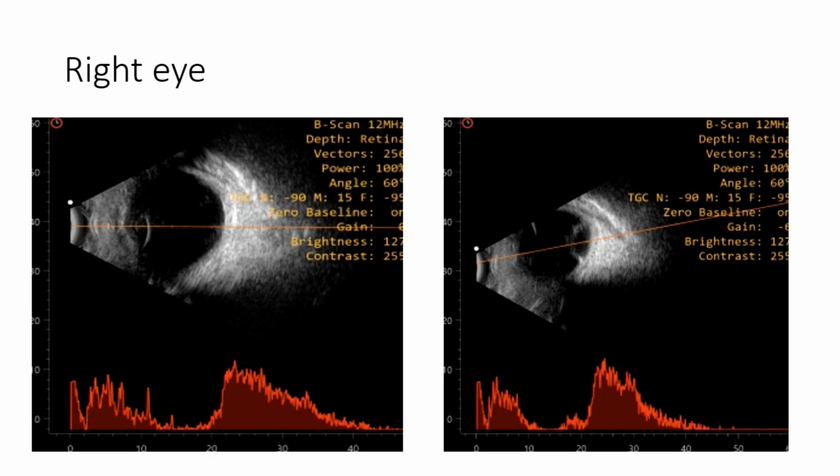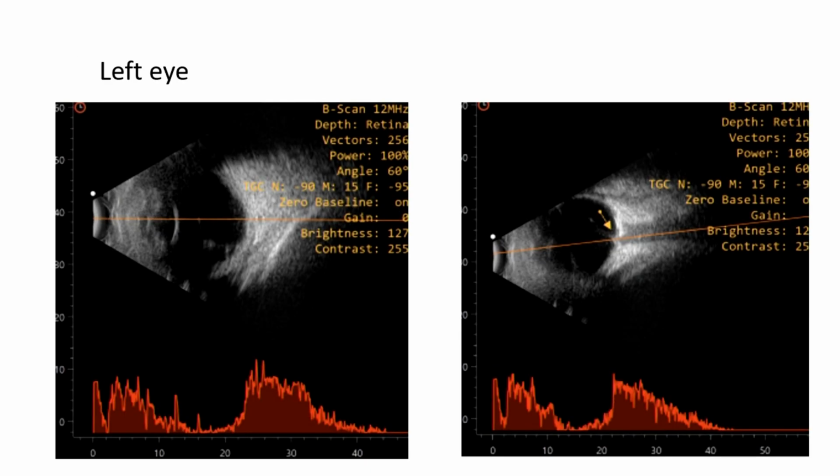Ultrasound was done, and in the right eye, a low reflective membranous echo was noted lying on the retina, but no traction was noted. And in the left eye, similarly, a low variable reflective membranous echo was noted, extending till the ONH, but it was not causing any traction to the retina. So tractional retinal detachment was ruled out, but the baby was still kept in close watch.